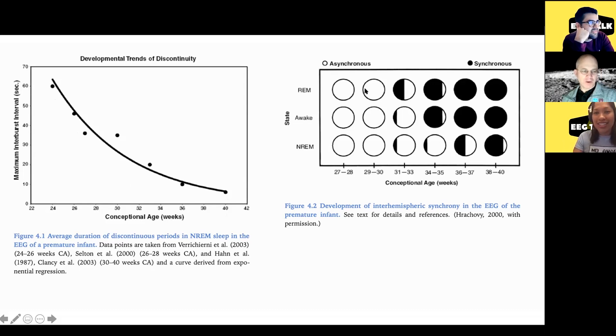Another point is that how asynchronous those bursts are also depend on gestational age. So on the right in this figure 4.2, we see that in non-REM sleep, like what we're looking at, essentially before 30 weeks, it's completely asynchronous. And as the baby ages, you get a little more synchrony as time goes on.